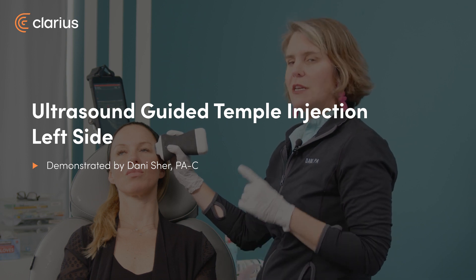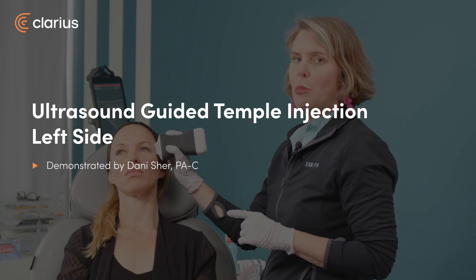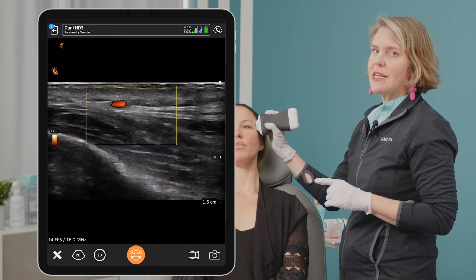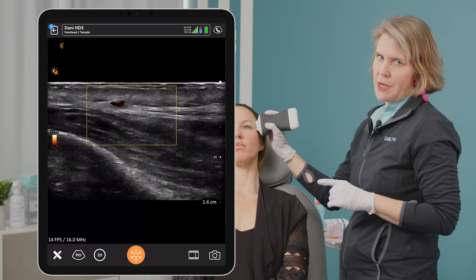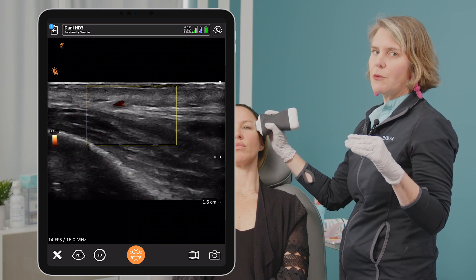Now we're taking a look at the left side, and interesting enough we do see the superficial temporal artery where we expect to see it in layer 3. Keep in mind we're going to be filling layer 2, so this is a great example of being able to monitor your cannula and be sure that you're above that SMAS layer where the artery is.